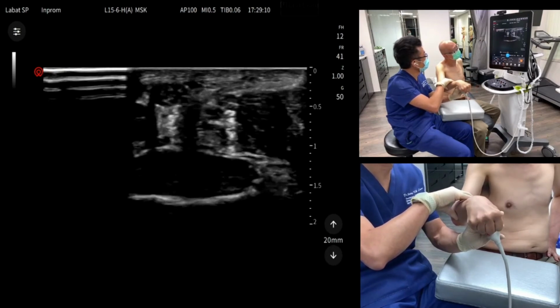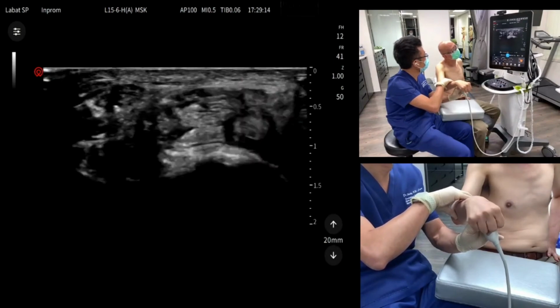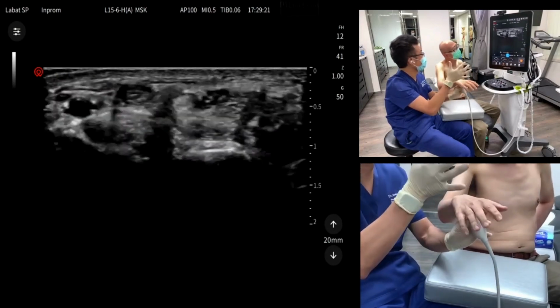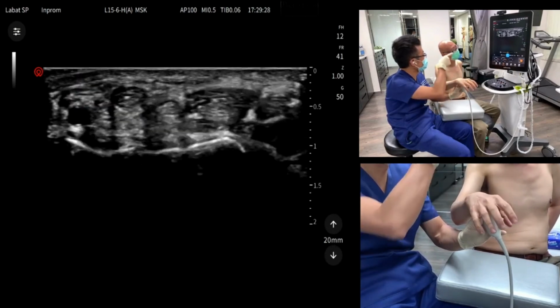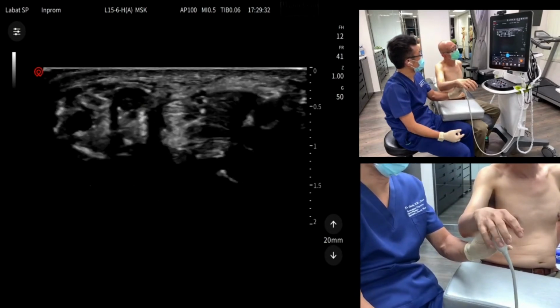Starting to feel any discomfort? You feel tired with your fingers or your thumb? Your thumb. Yes, your thumb, because that's your thenar branch or the recurrent branch of your median nerve, which is right next to your flexor pollicis longus, which is being squeezed by doing this.